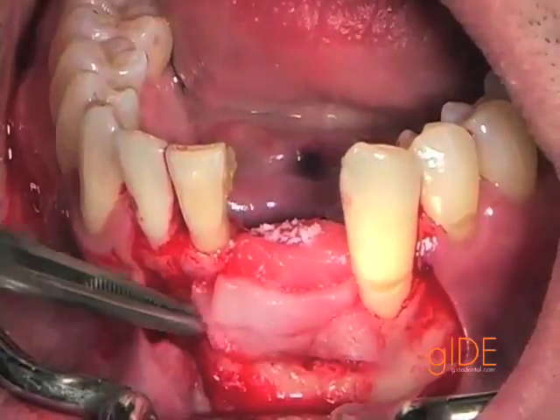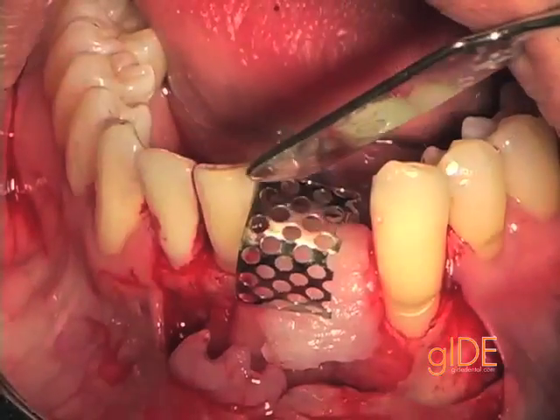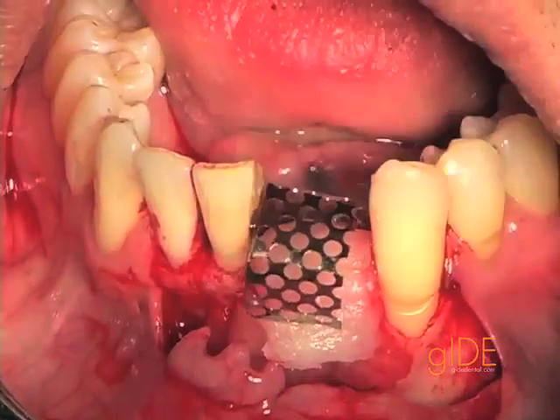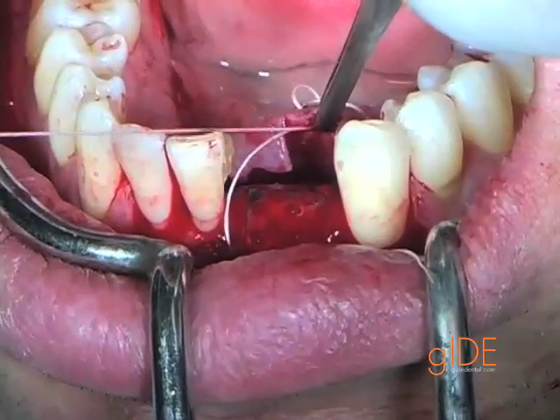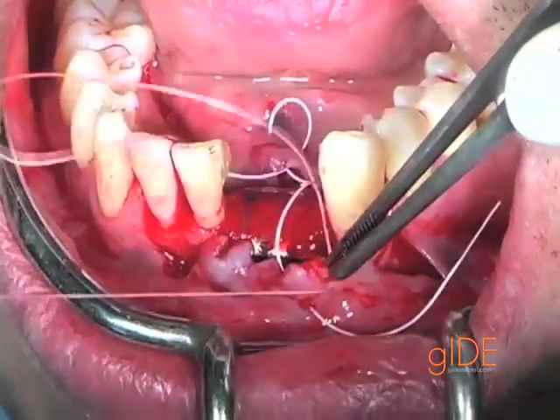The collagen sponge is slightly compressed — not too much. Now we're applying the titanium mesh, then we use the horizontal mattress suture which comes in the middle of the flap.